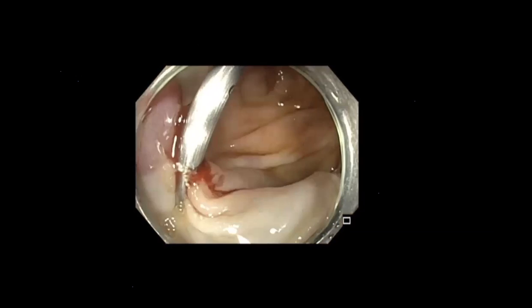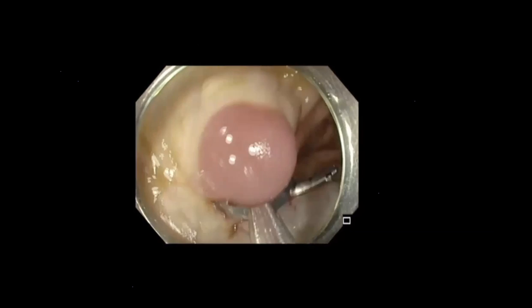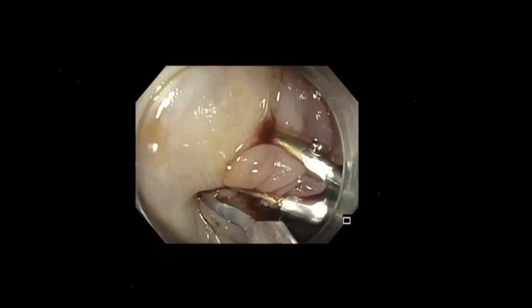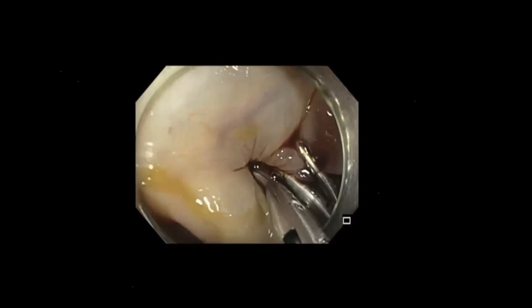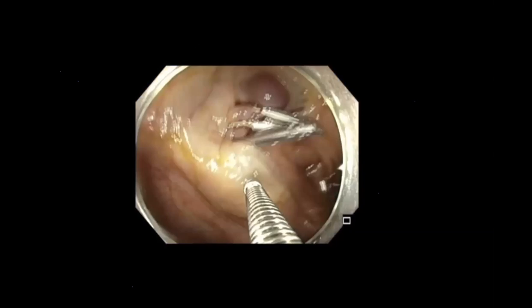And as you can see, once we applied a clip, there was a little bit of blood from the deep, indicating that there was a vein. If you actually go back to the first video and look closely with the MBI, you could see a big feeding vein underneath that submucosal bulge. It's interesting that I did not see that at the time of the procedure.